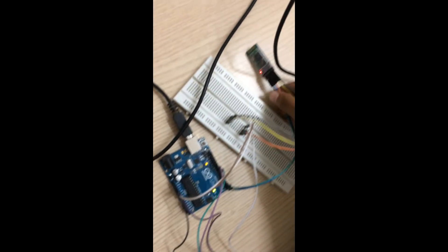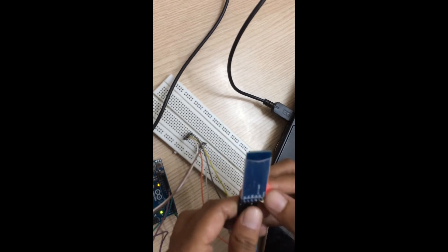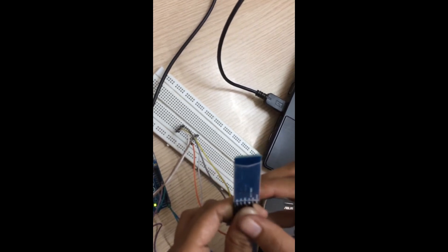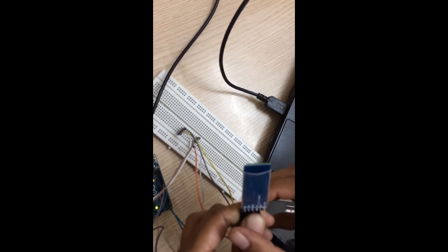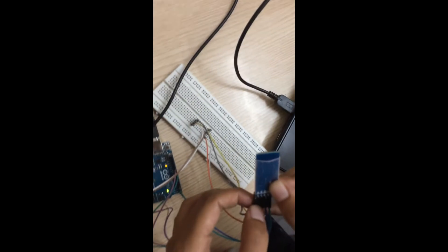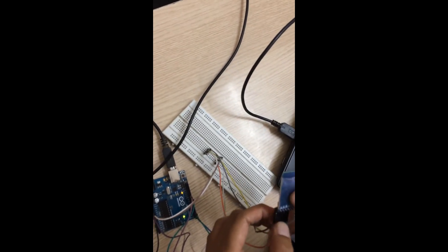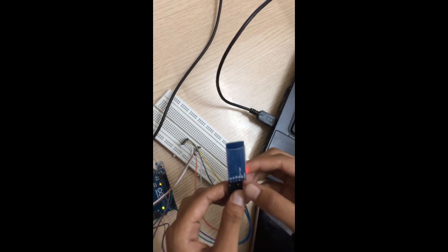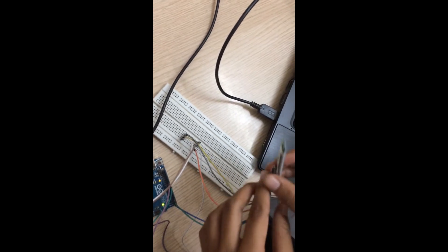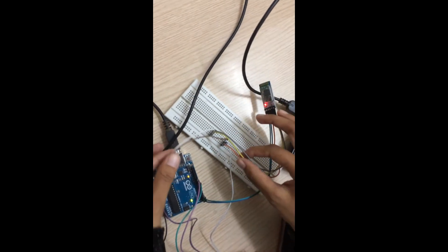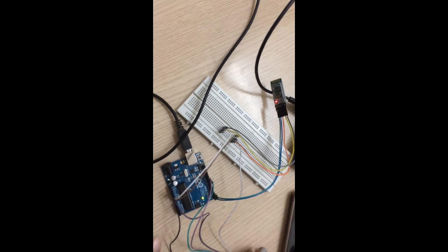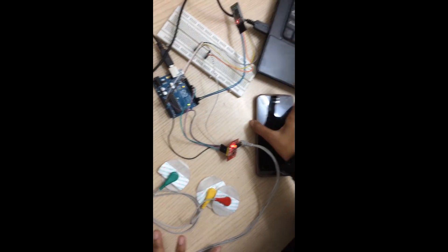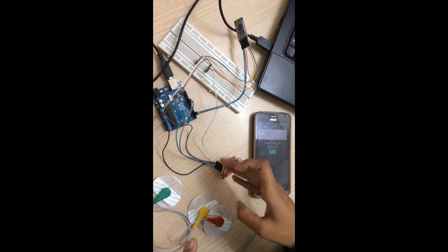This is the Bluetooth HC-05 module. It has six pinouts: state, transmit, receive, ground, VDD, and enable. We are connecting the VCC and ground to the respective pins, and the transmit and receive pins are cross-coupled. You can see the connections here.